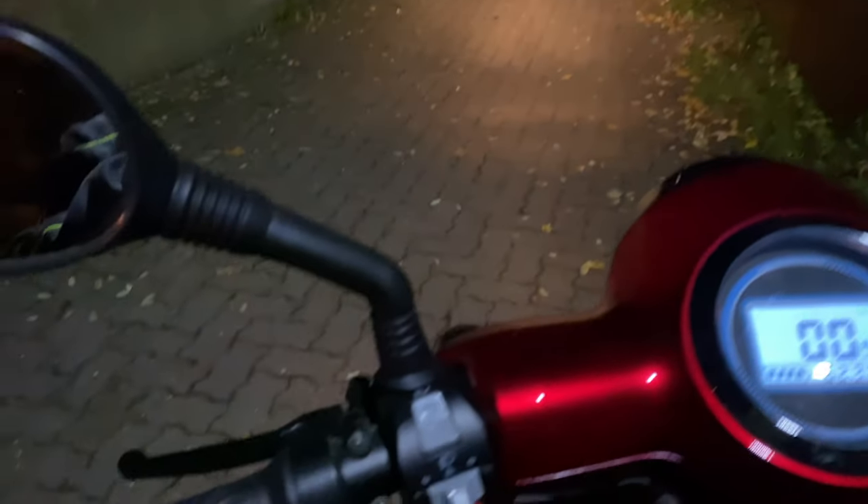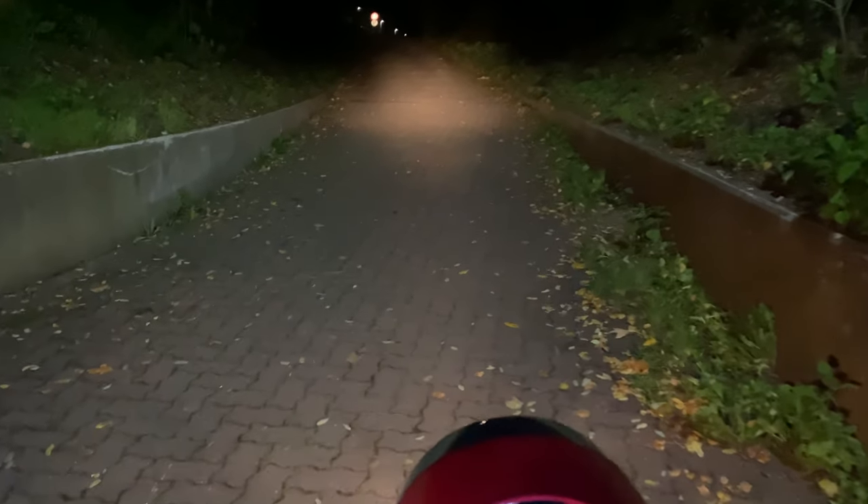Now I want to show you the lighting on a short night drive. The high beam is switched on here.